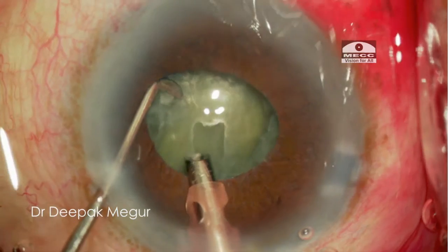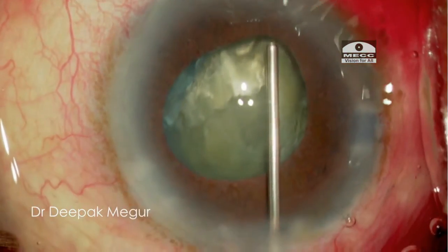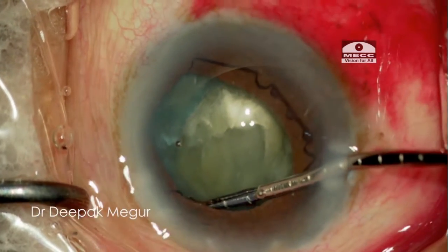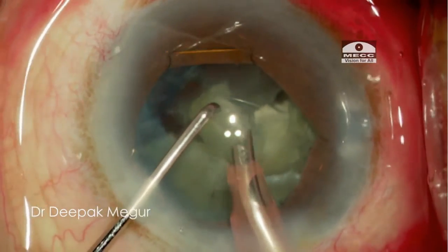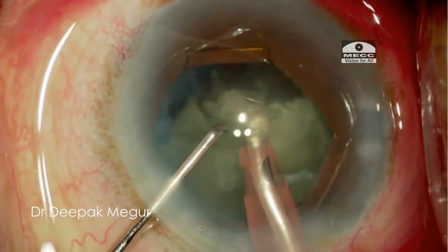Here the pupil becomes small as FACO is commenced. A little viscoelastic lifts the iris off the capsulorrhexis. The uniplanar design and open notches ensure that the capsulorrhexis is not engaged as the flanges are tucked. As the flanges are tucked and advanced, there is instant confirmation, and now we are back to our comfort zone.